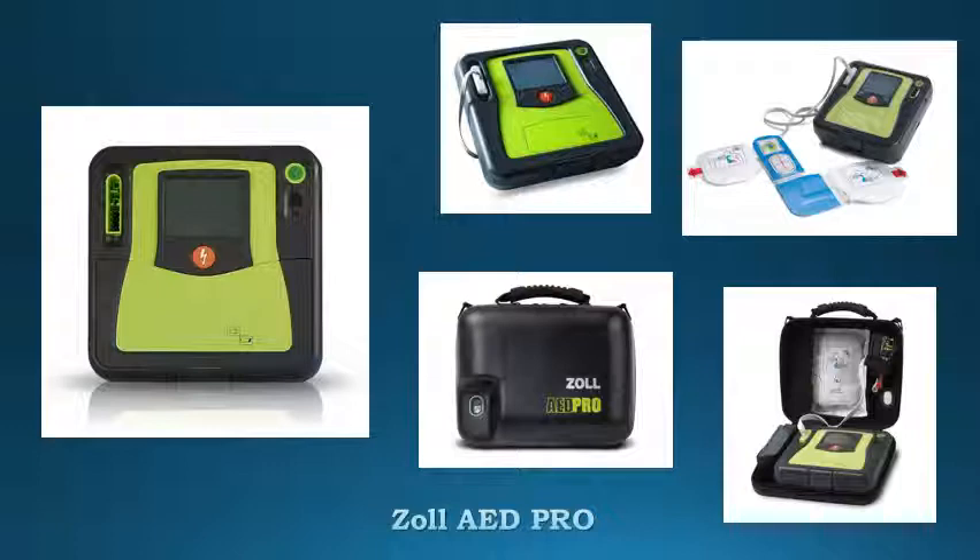Electrode compatibility with ZOOL E-series, R-series, and X-series professional defibrillators. Battery compatibility with the E-series and R-series.